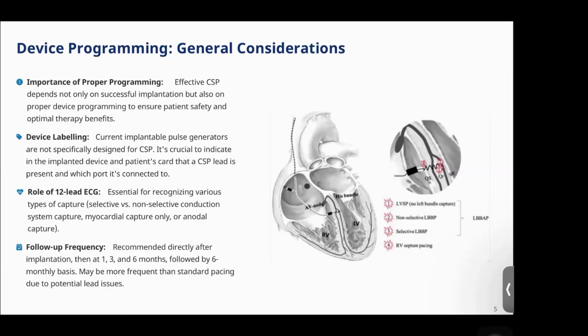So it's crucial to indicate on the implanted device and patient card that a conductive system pacing lead is present and which port it is connected to.